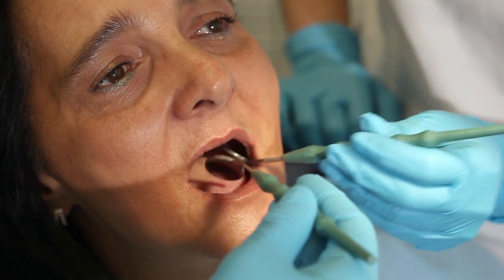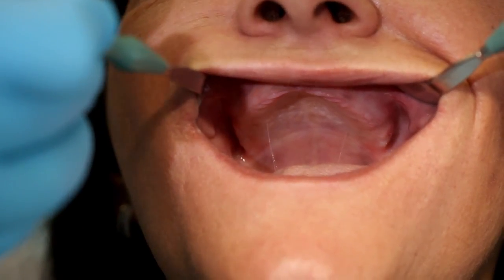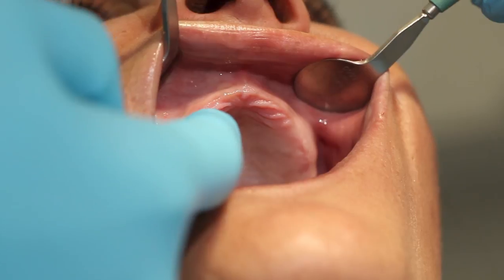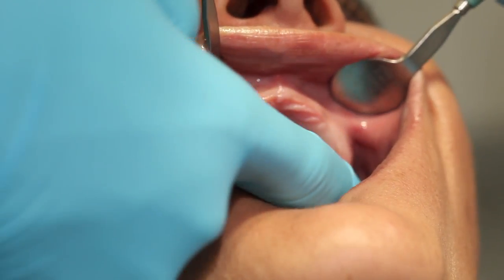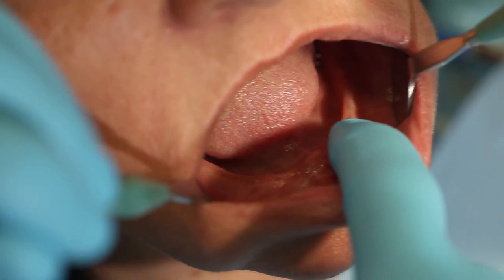During the intraoral examination, examine and palpate the mucous membranes and the alveolar ridges. Watch out for pathological changes and evaluate the general condition of the alveolar ridges, including the degree of resorption.